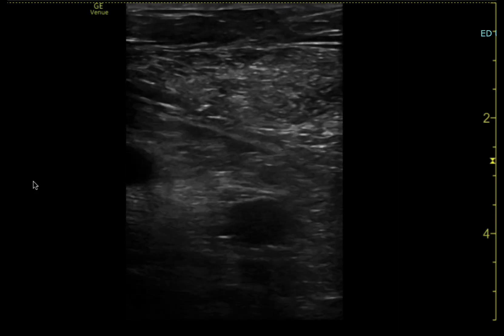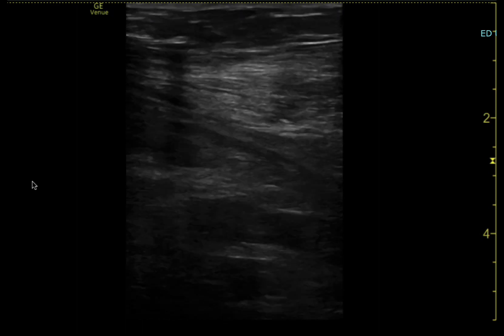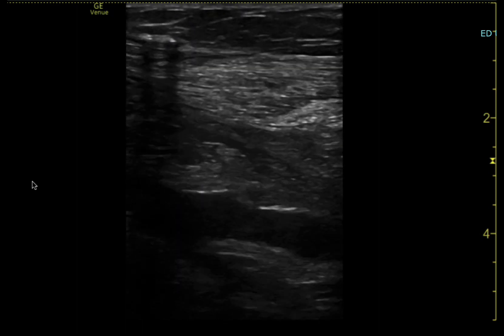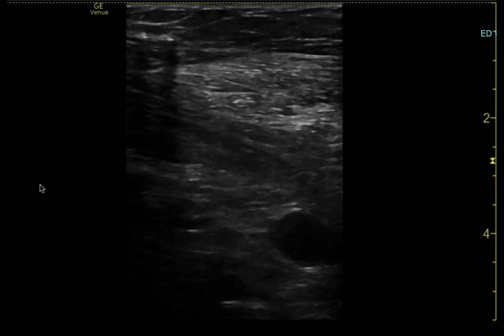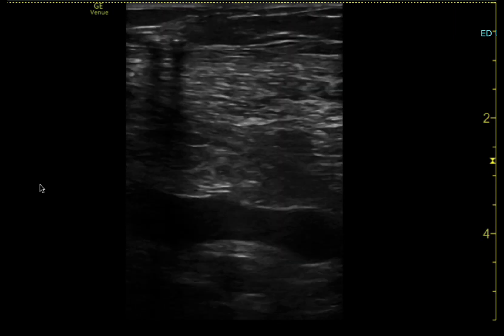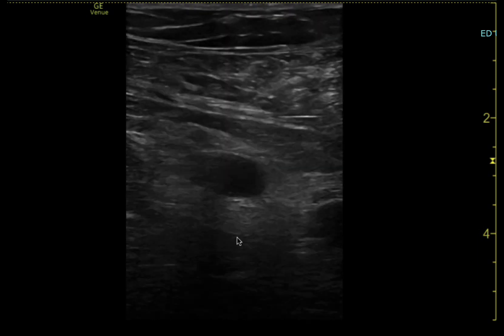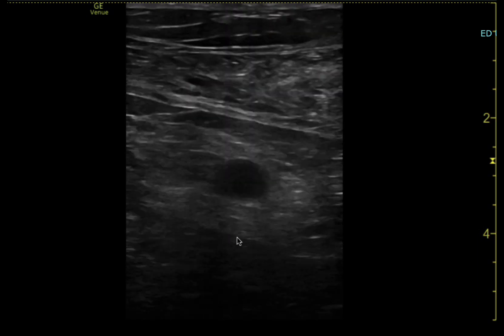I thought I'd do a quick video on my process for ultrasound-guided central lines. The first thing I want to do is find a suitable target, and my first choice is usually the left subclavian. I'll look to evaluate the target — this is how I like to find it.